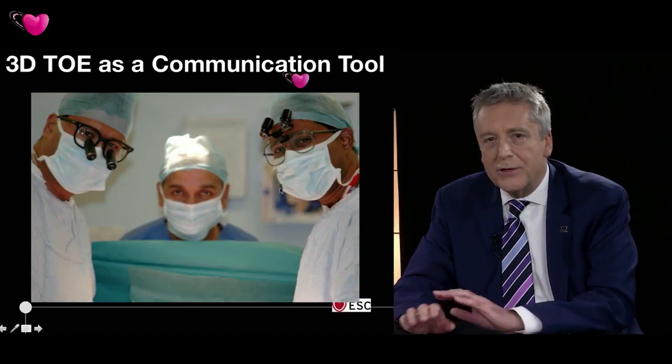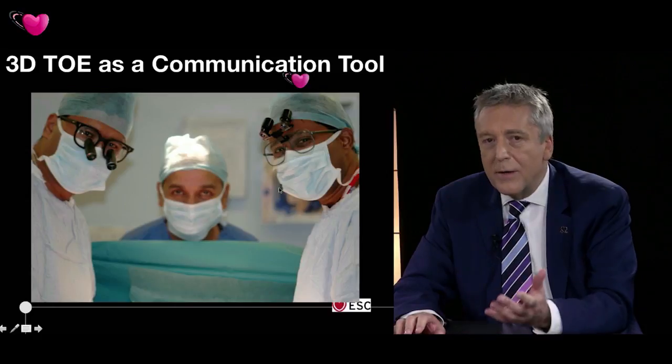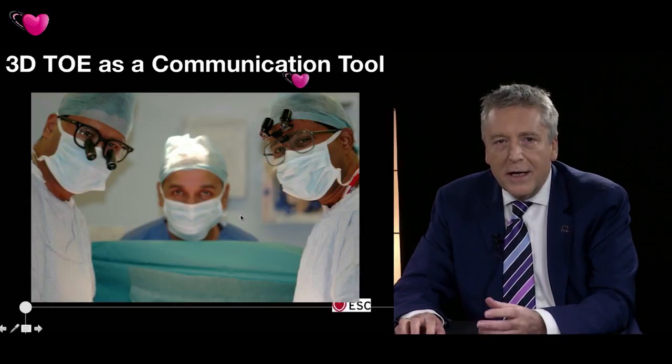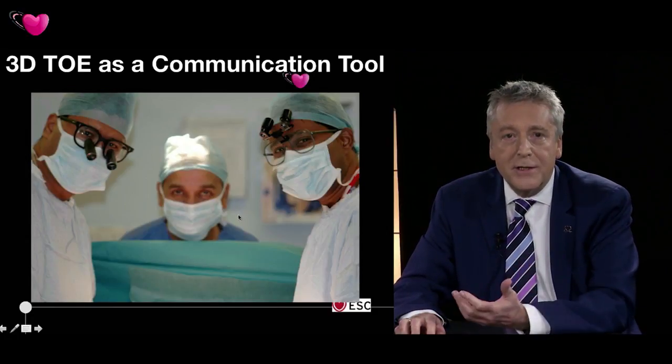And this is a picture I took in our cardiac operating theatre, or one of our operating theatres, during a mitral valve repair. And here are two of our cardiac surgeons and the anaesthetist. And the information that we acquire from echocardiography is the information they need.